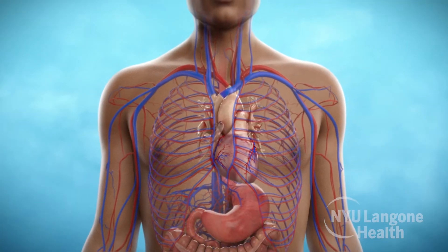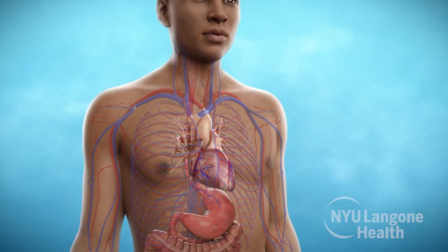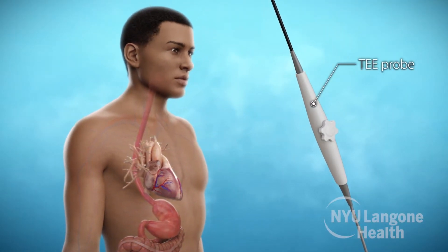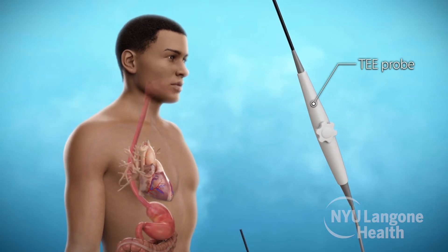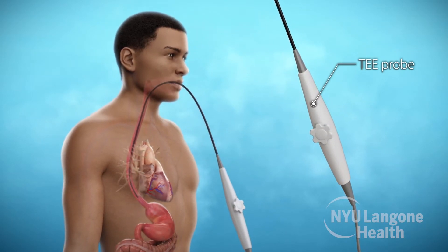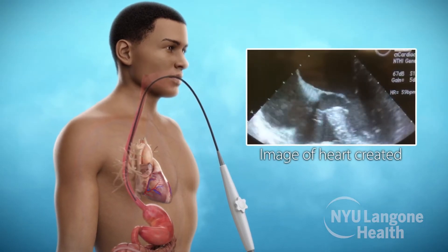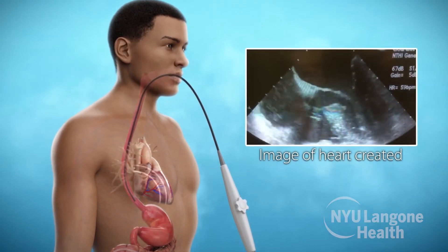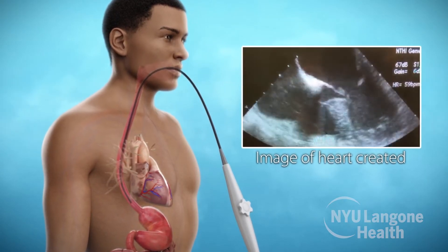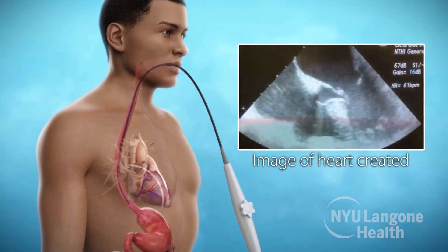Before surgery begins, transesophageal echocardiography, or TEE, is used to get a real-time look at your heart. TEE is a probe that is advanced down the throat and into the esophagus where it creates an image of the heart. Your surgeon consults with your HCM cardiologist to confirm that the surgery as planned is appropriate based on these images.